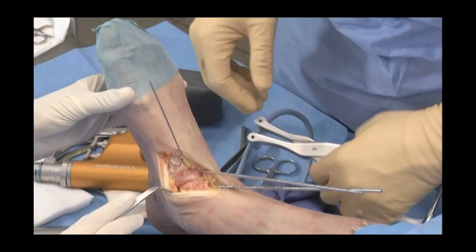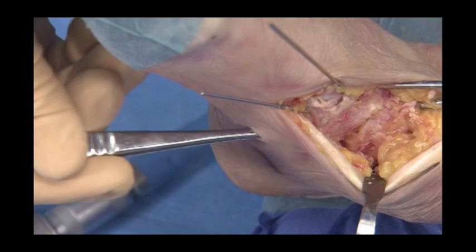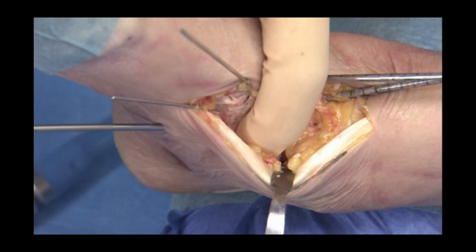One should make sure to avoid the neighbouring joints while drilling. If a bone defect is present, one should place the screw on the healthiest side in order to achieve some living bone-to-bone compression before filling the defect with bone chips.